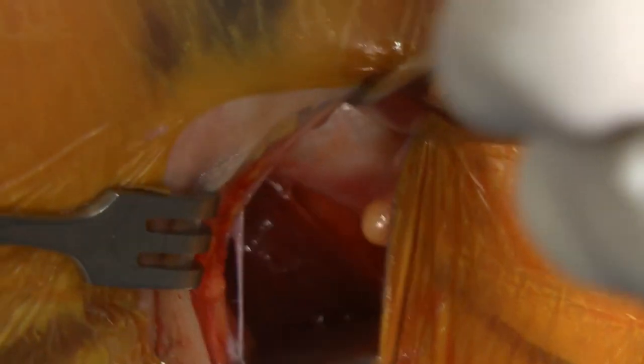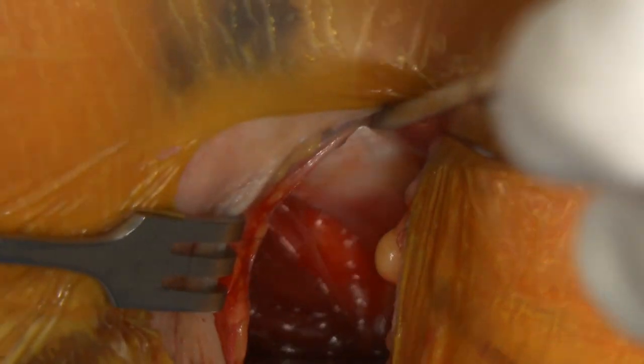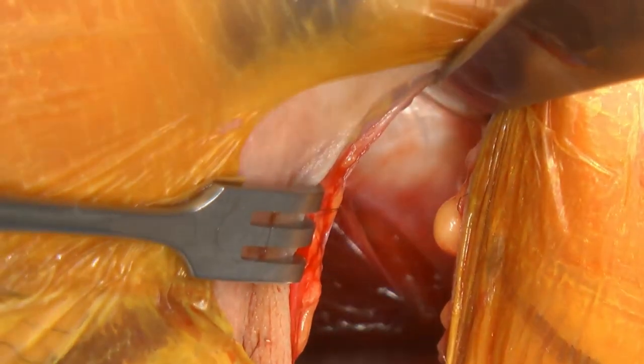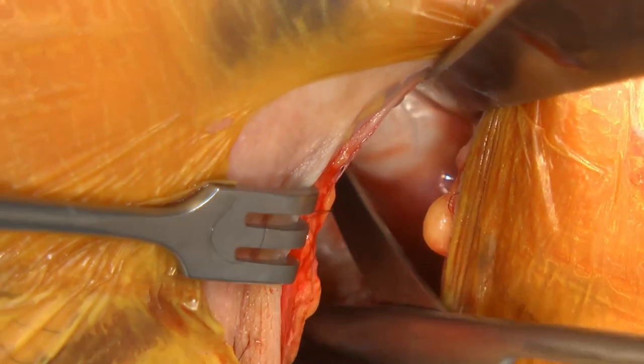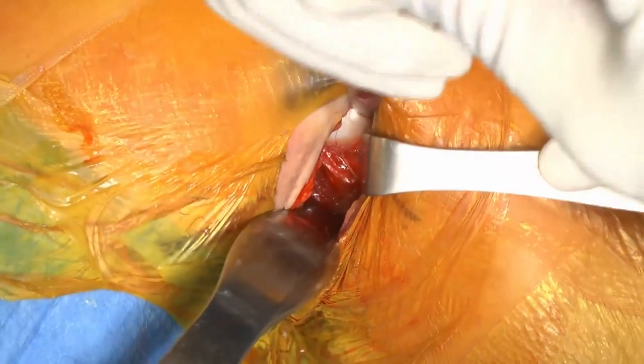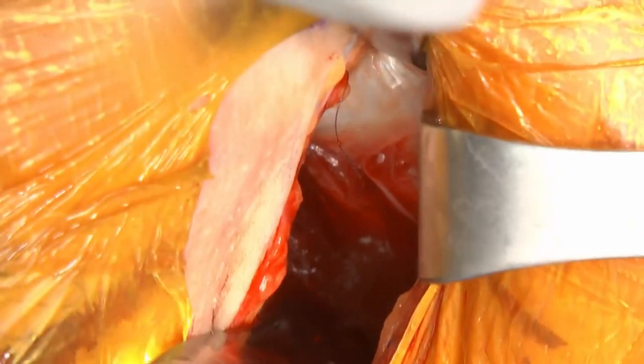We have, that's the pec tendon. This is the biceps tendon, the biceps muscle. And as we go down in this region, we'll see right where the pec inserts is the bicipital groove, and then next to that. So we have the pec pulled back, we have our army navy in here, and then let's see if we can get a view in there.